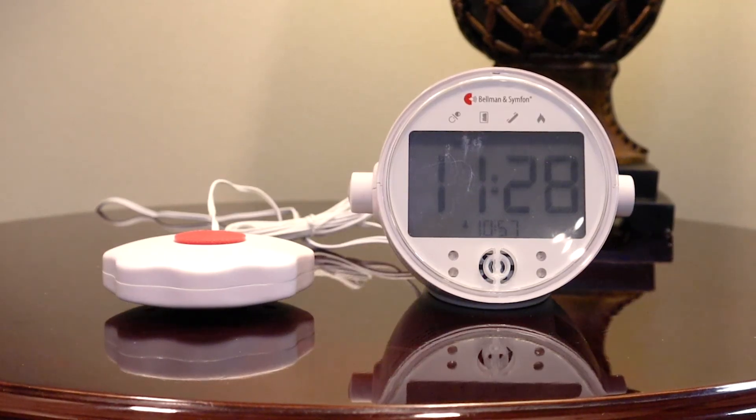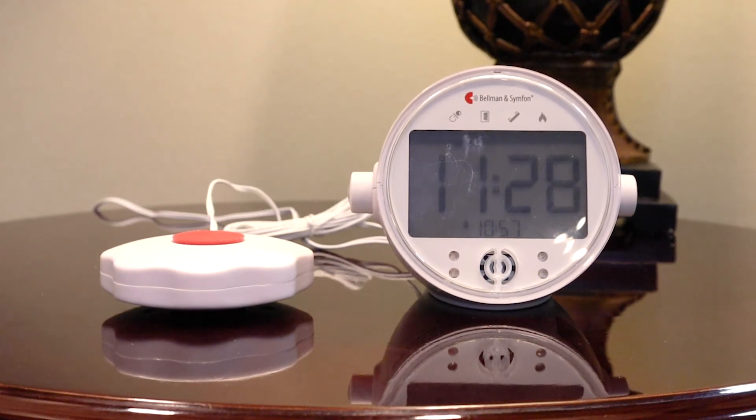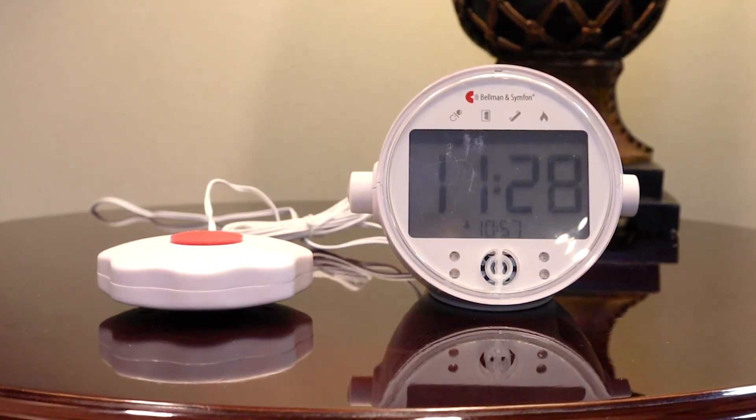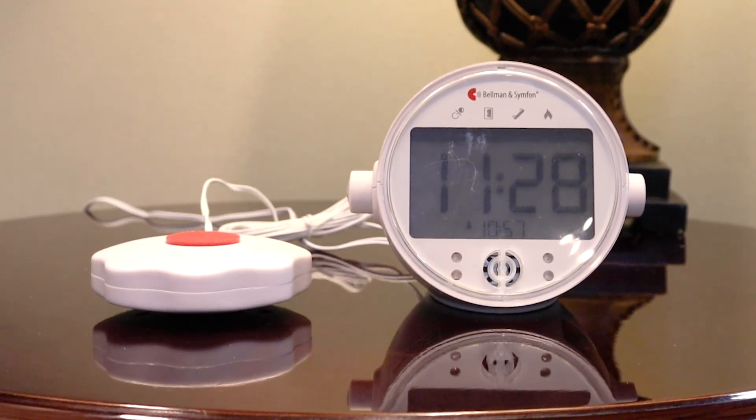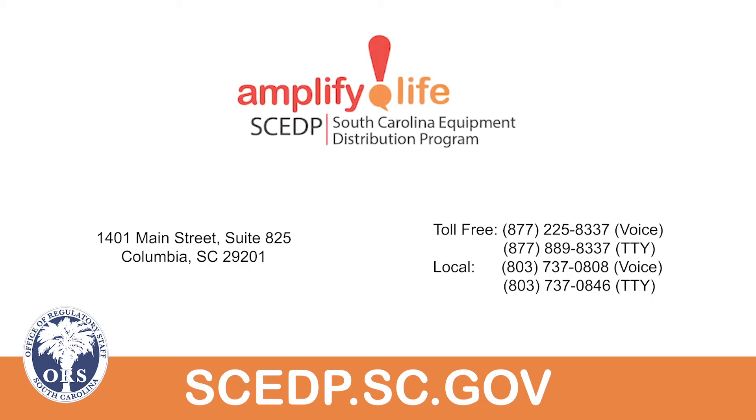This concludes showing how to use the main features of your alarm clock. For information on the available accessories that work with your alarm clock, view the Using Accessories with the Alarm Clock video.